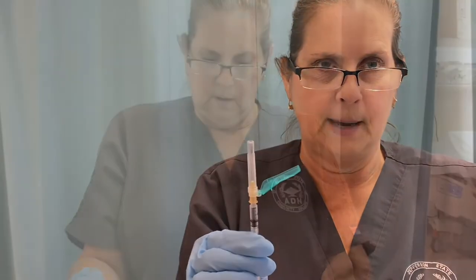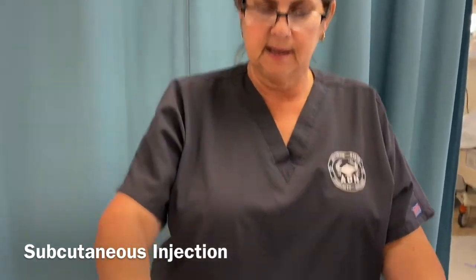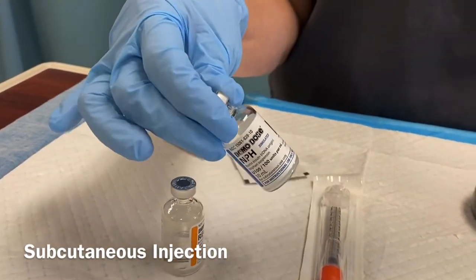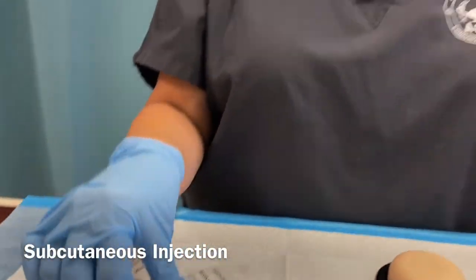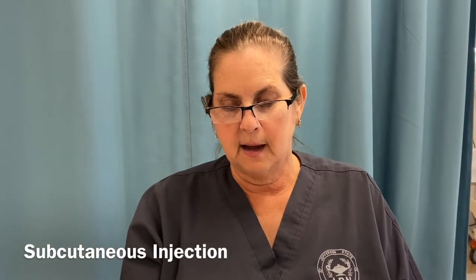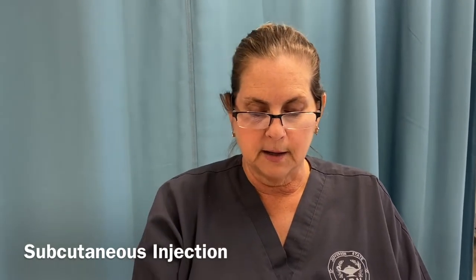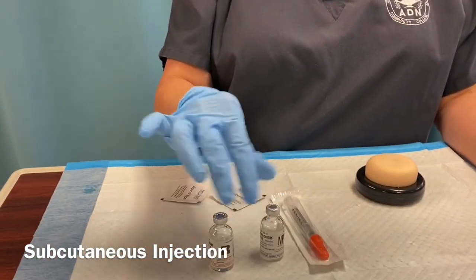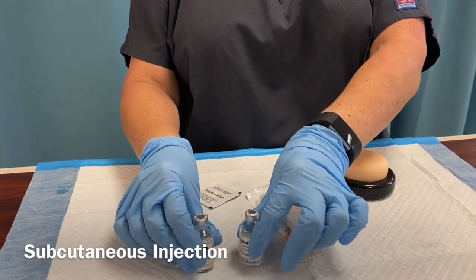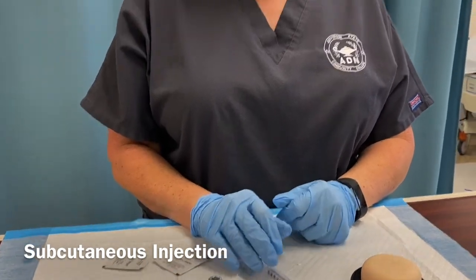Now you're ready to go give your injection to your patient. You're going to learn how to mix insulins — two different types of insulins from two vials into one syringe. They do make preparations now where the insulins are in a pre-filled syringe for the patient to use; however, those are more expensive pre-filled syringes. A lot of doctors now will order the regular insulin and the NPH insulin separate. More hospitals are going back to this method as well, because it is less expensive. This is known as a sub-Q injection — we're going into the subcutaneous tissue.